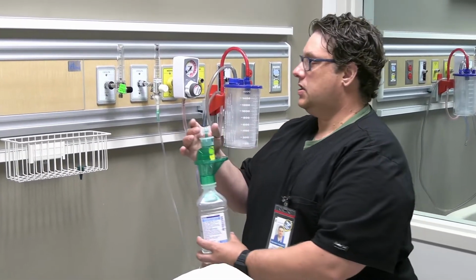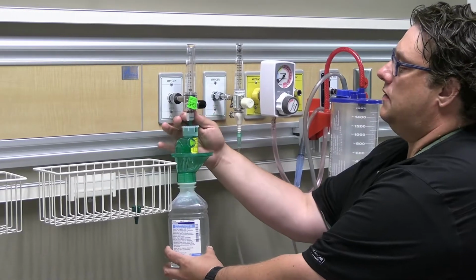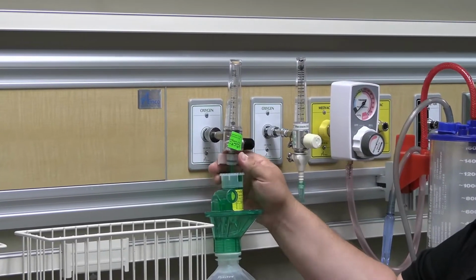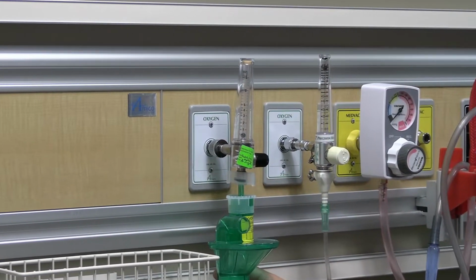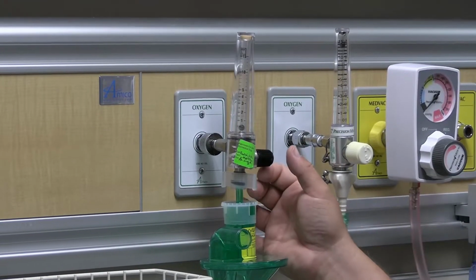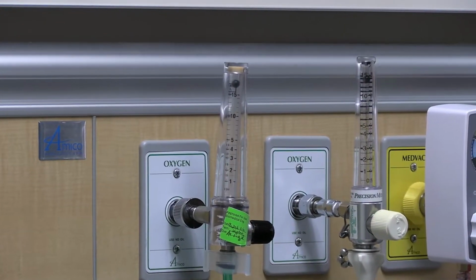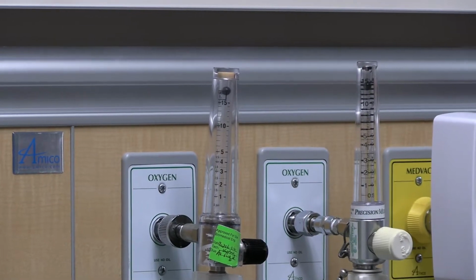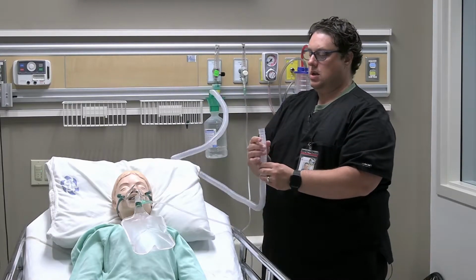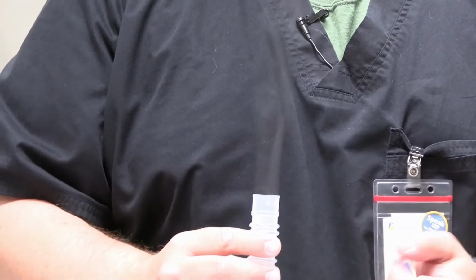So now we're going to attach our HiOx system to the oxygen flow meter. Remember, we've already set that to the highest of 96%. Again, be careful when you're screwing that on not to cross thread as you are. Again, it is just plastic. So get that on there just like that. Now there is a bit more weight to this than the other setup, so just be aware of that. And I'm going to turn that on to 15 liters per minute. Start to see some mist already coming out of the HiOx system there. Going to attach my corrugated tubing. Again, you can do the mist check there. Okay, we see a nice flow of mist coming out of there for the patient.